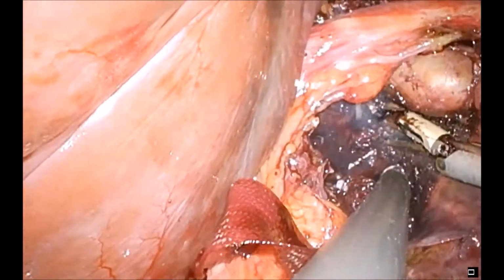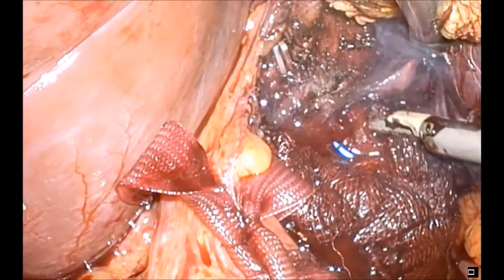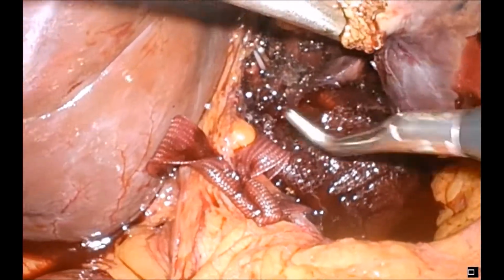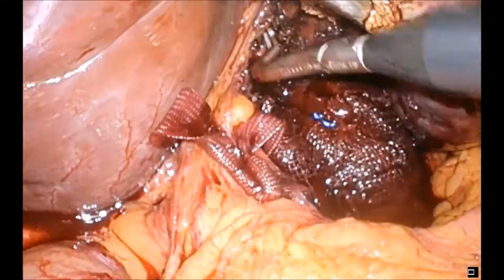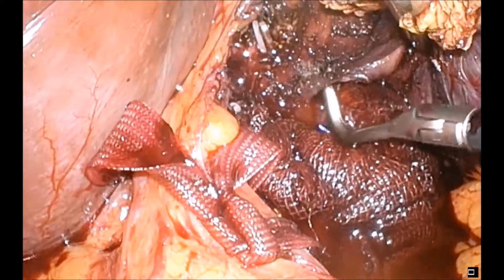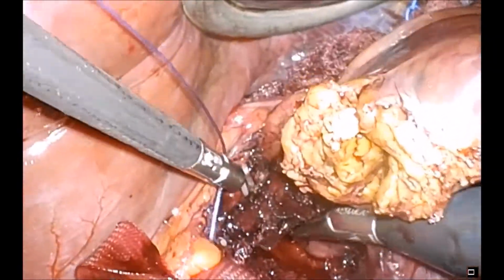You'll note there's not been any formal dissection of the porta hepatis itself, rather the whole operation, because it's for a suspected adenoma, has been up against the caudate lobe. Here we're back underneath the caudate lobe, really taking the last attachments back towards the porta hepatis.